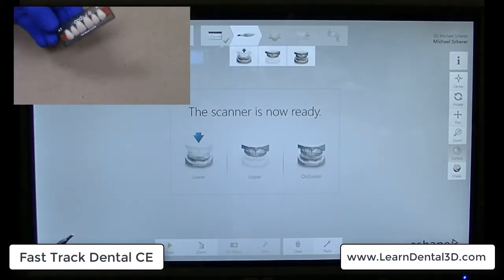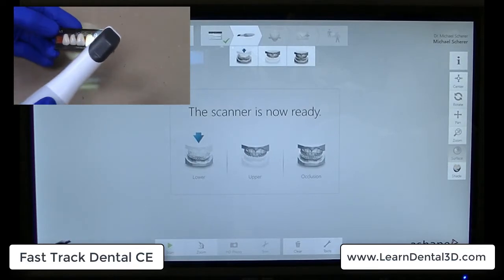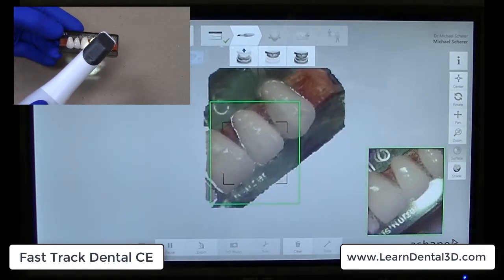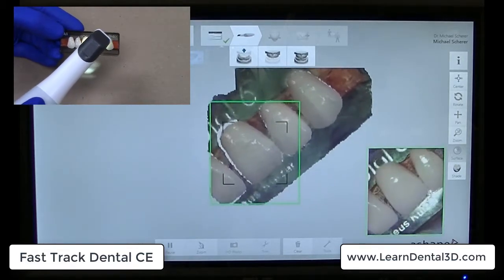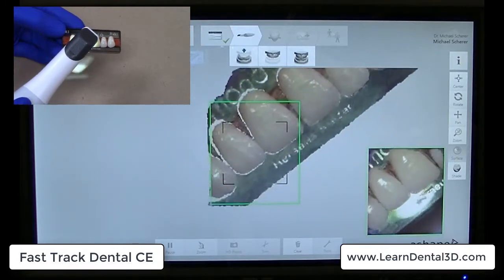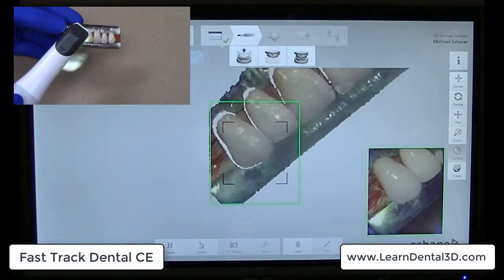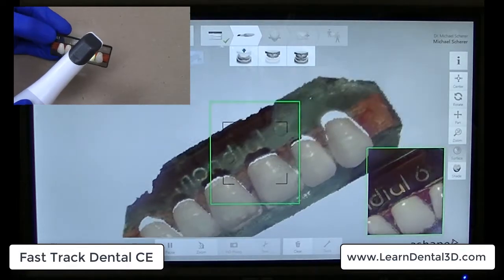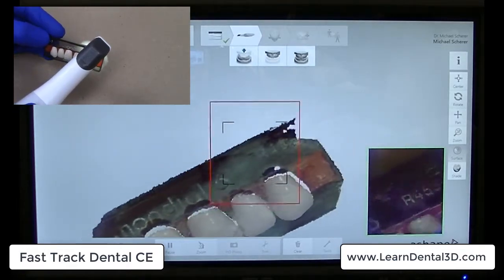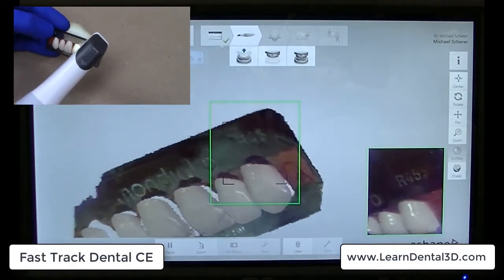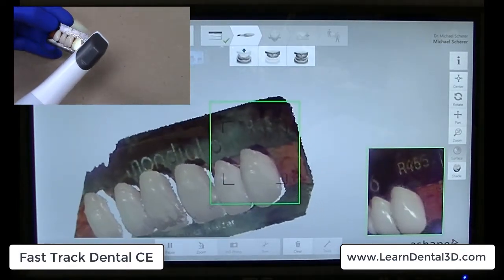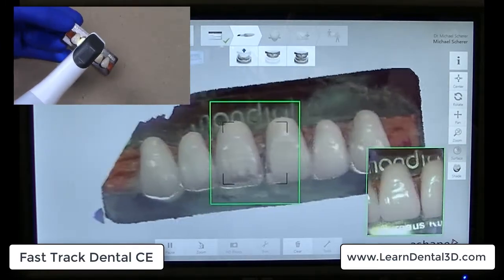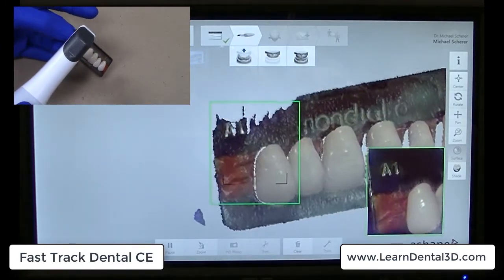I'm going to pull out my denture tooth card, take my Trios wand, and click the activate button. Starting by scanning on the facial aspect of my denture teeth and on my denture tooth card, Trios automatically starts capturing some of the denture tooth card. Hovering around different corners and different aspects of my denture tooth card, it makes for very short work for doing this task.